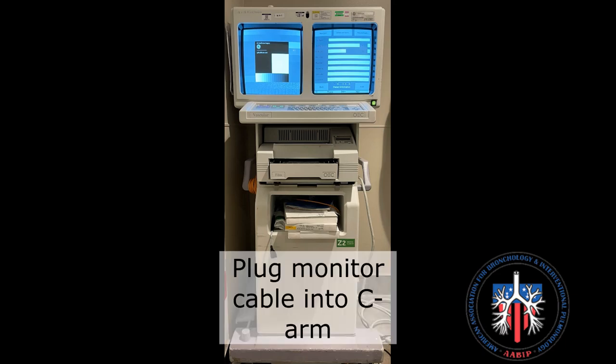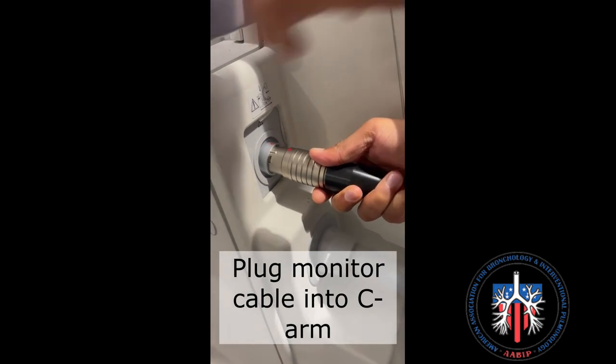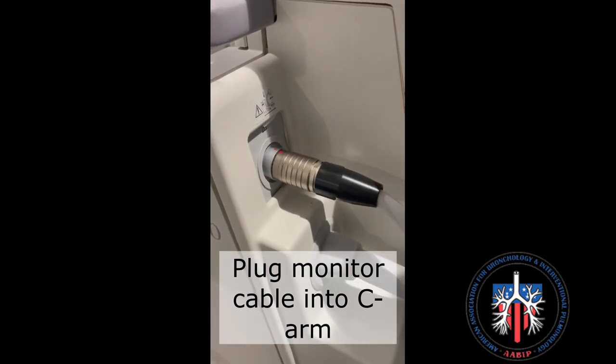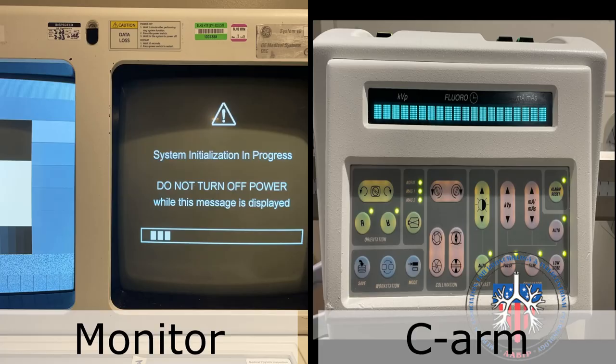This is the monitor. The monitor is plugged into the C-Arm as shown here. This is done before turning on the C-Arm. Next, turn on the C-Arm by pressing this button on the monitor. This screen will appear on the monitor and the C-Arm will look like this.